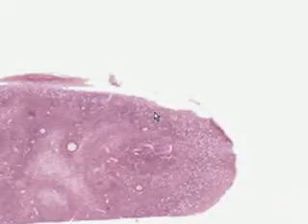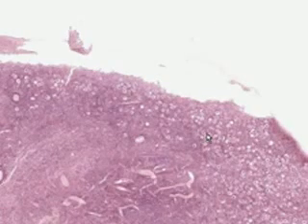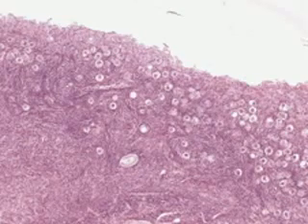A good place to start in describing the histologic features of the female genital tract would be an ovary. This is a human ovary. It's a human ovary in an infant because it contains many features you would not find in an adult ovary. First of all, these individual cells you see here towards the cortex or the periphery of the ovary can be called, for lack of a better term, oocytes, or simply ova. They are the first stage of development of the follicle.